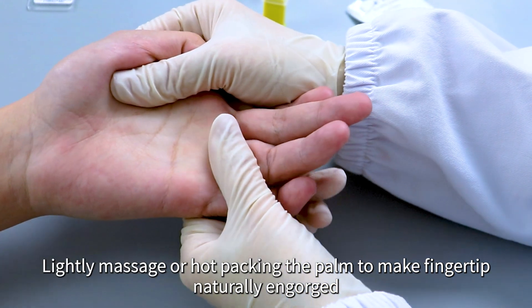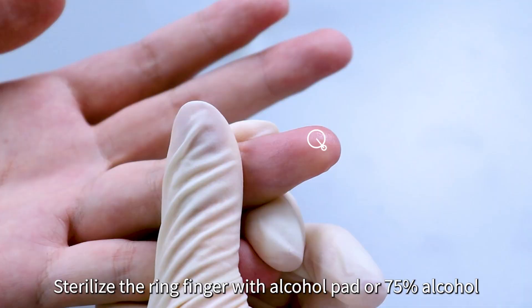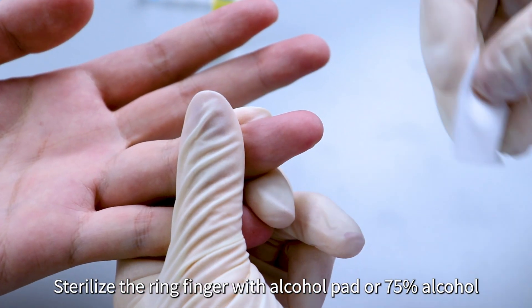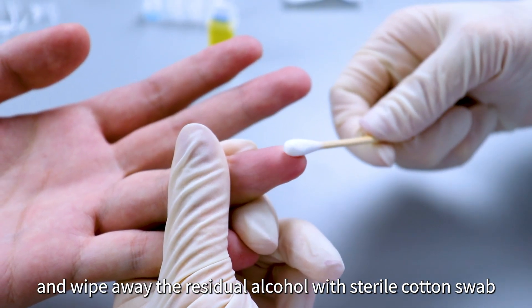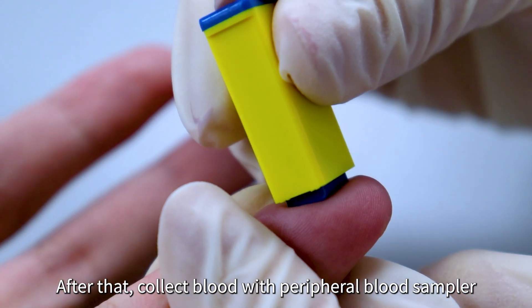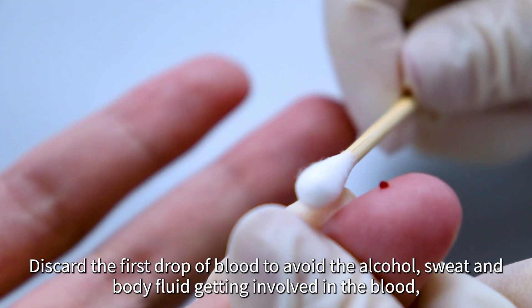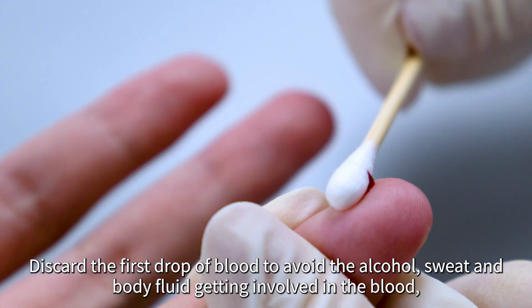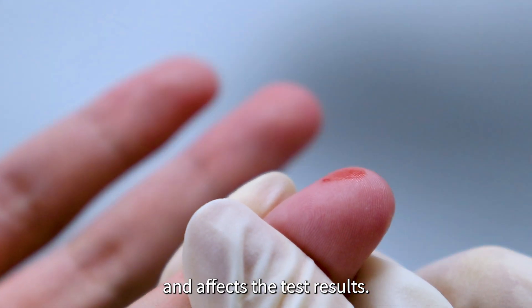Lightly massage or hot pack the palm to make the fingertip naturally engorged. Sterilize the ring finger with an alcohol pad or 75% alcohol and wipe away the residual alcohol with a sterile cotton swab. Discard the first drop of blood to avoid alcohol, sweat, and body fluid getting involved in the blood and affecting the test results.